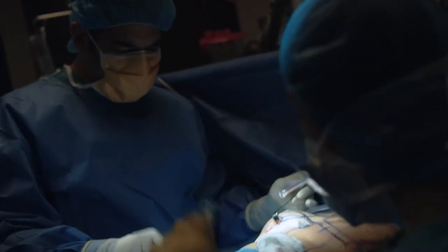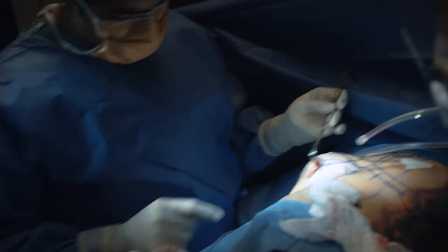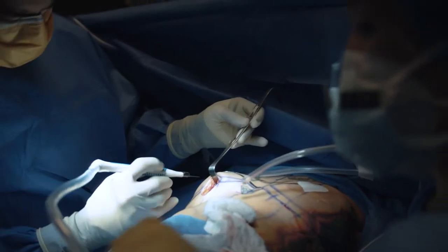This is red here. This is the pectoralis major muscle. That's what we're trying to identify. Now I'm going to go under the muscle. Before I do that, I just stop all the little bleeding blood vessels.